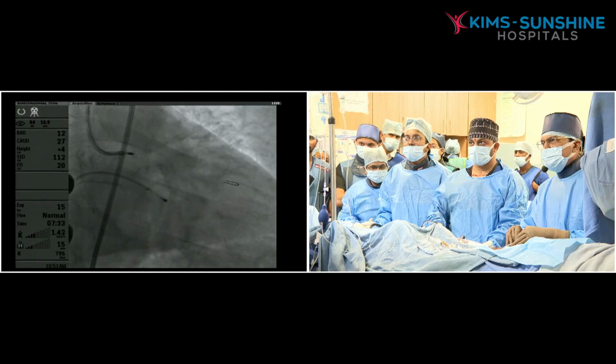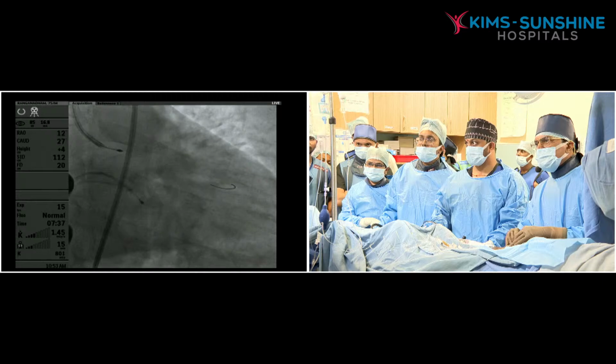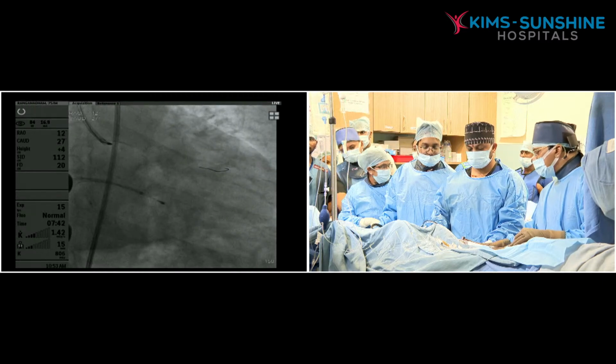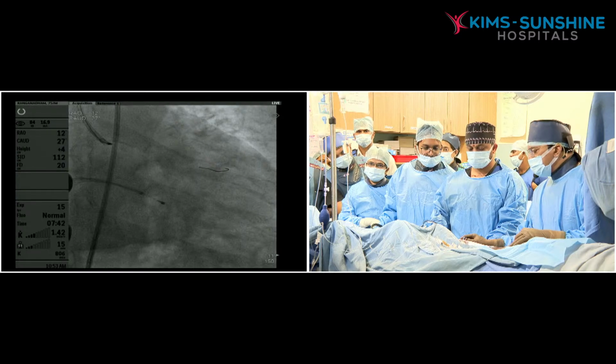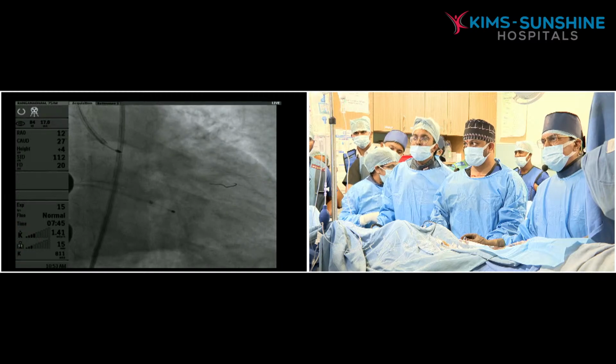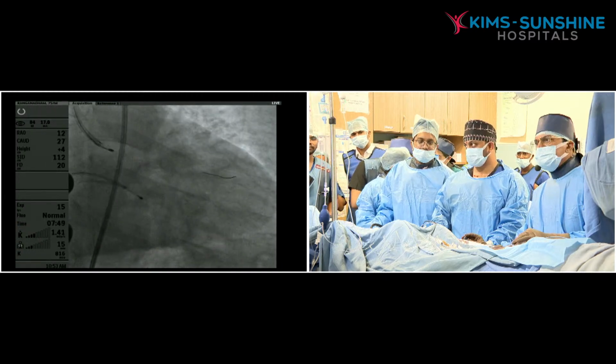I have to pull it. Always here you should lock it, but it was locked there only. That's fine. Right, now it will go. Right, okay.